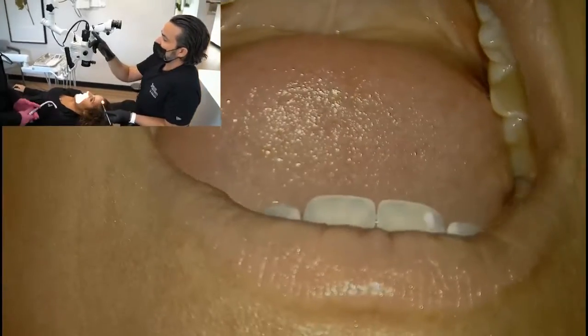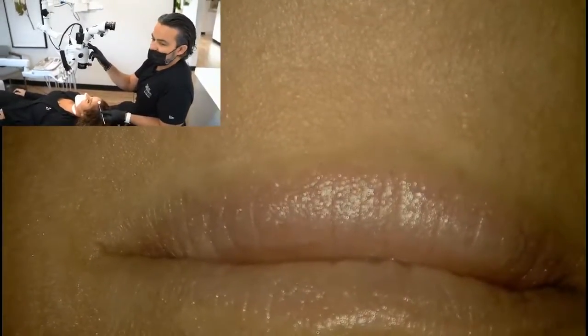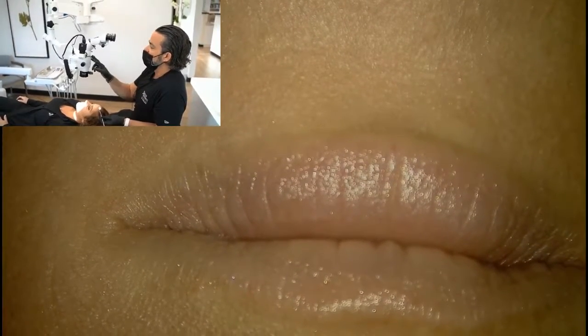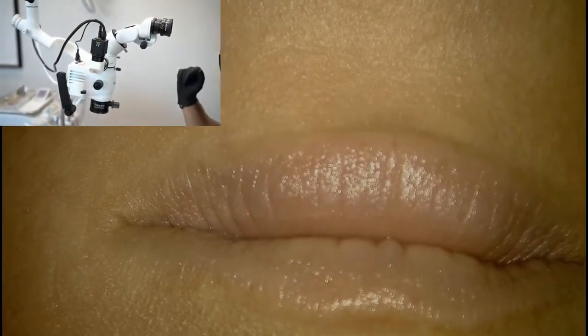Now, that's point one. Point two, if you do cameras, I've got another variable up here. This is a beam splitter, and then I have a variable up here where I can parfocal this for this. So let's talk about parfocaling then.